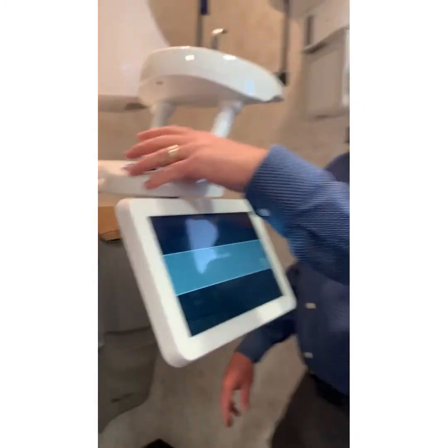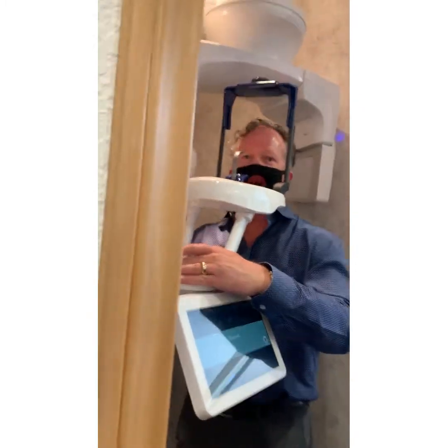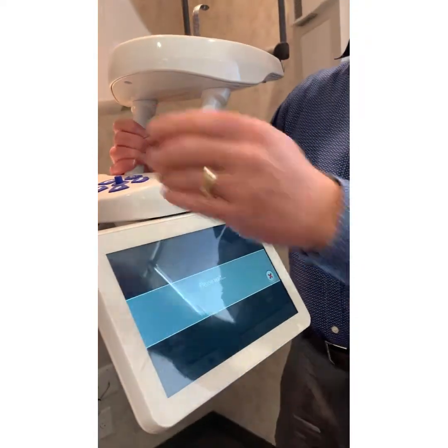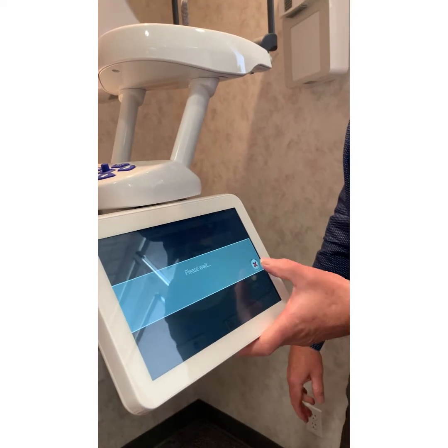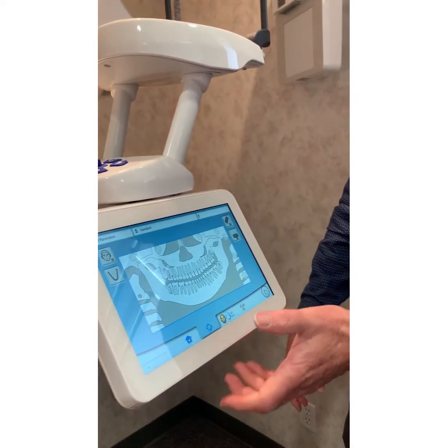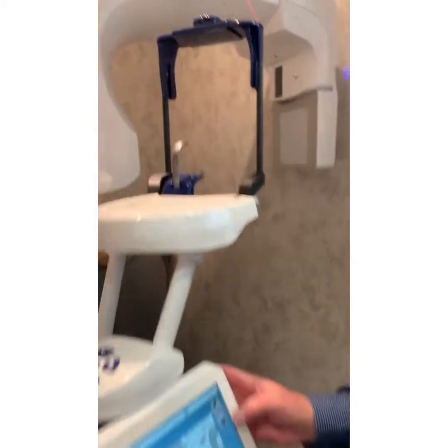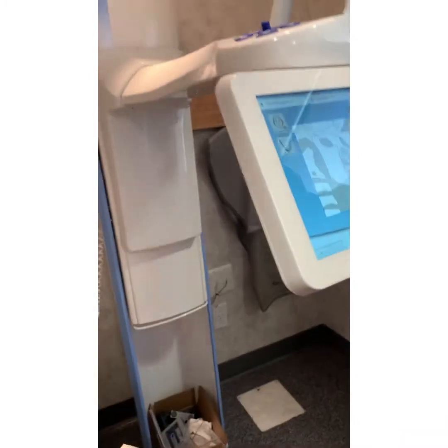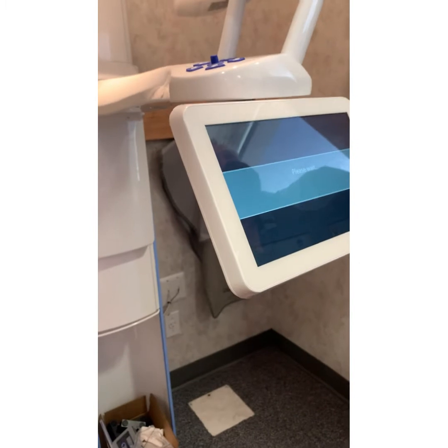That's what they were wondering, how I got that patient through that. That was on waiting mode. What mode? How did you get there? Was it blocked? No, it's okay, we're good. Right there, correct. Upper right button, and these right here. This just shows it pulled out of the way.